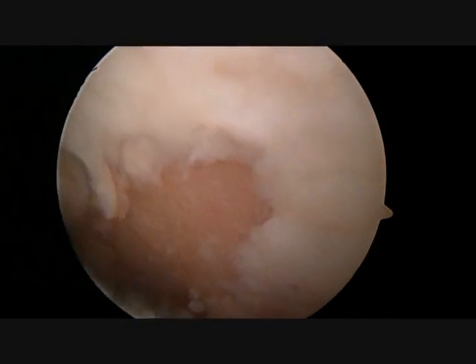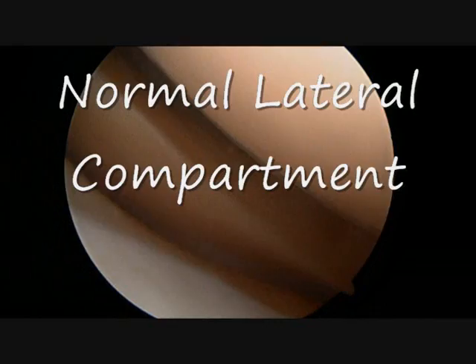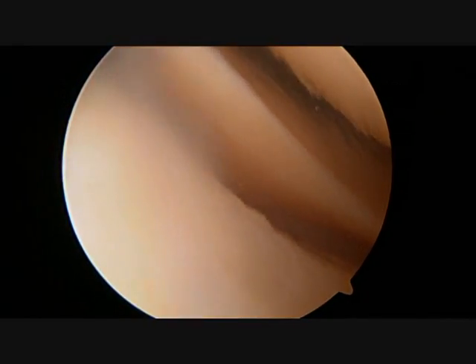The yellow area appearing under the cartilage that is loose and being removed is exposed bone. This shows very advanced arthritis that will ultimately need a knee replacement.